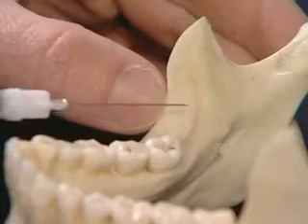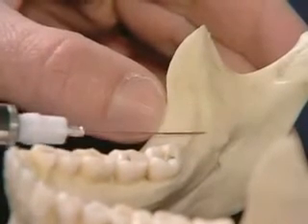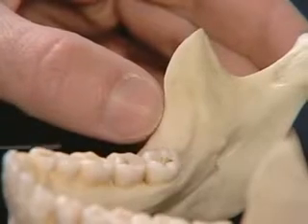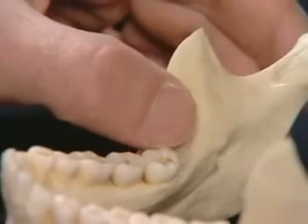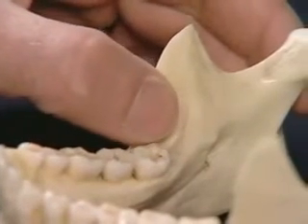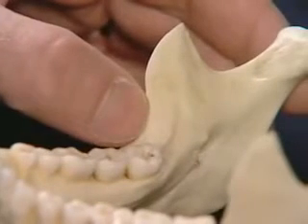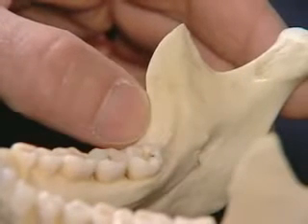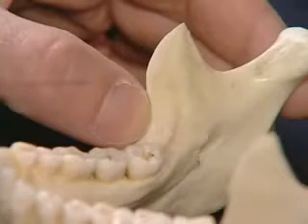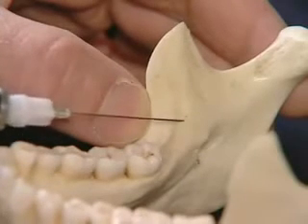The next stage is to palpate the internal oblique ridge, which is the next prominence as you move your finger or thumb in medially. That should be palpated, a mental note made at that point, and then your finger or thumb withdrawn laterally, pulling the soft tissue landmark with you. It is just medial to the internal oblique ridge that the needle will be inserted.